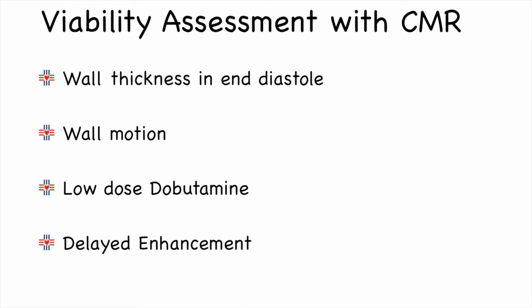So, viability assessment is important. Segments which are viable need to be revascularized, and segments which are non-viable need to undergo optimal medical therapy. How do we do viability assessment with cardiac MR?